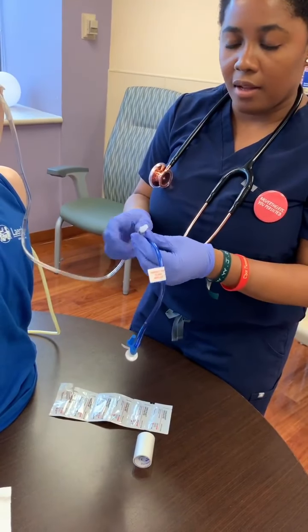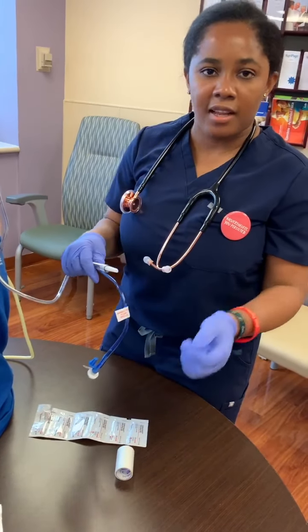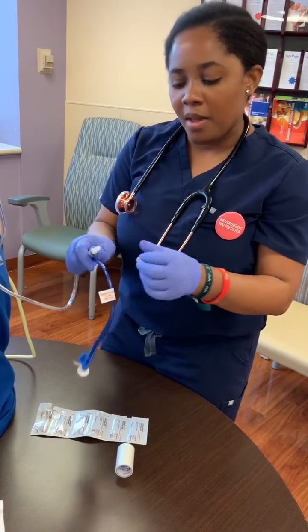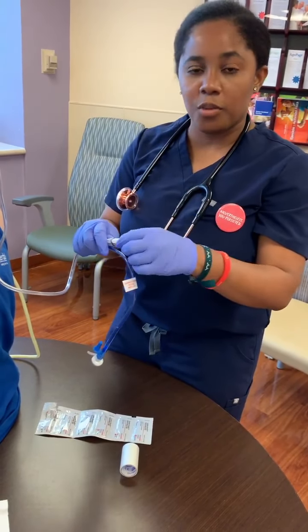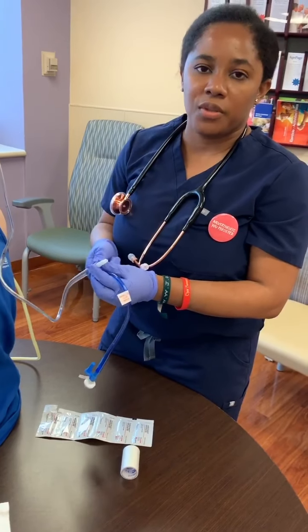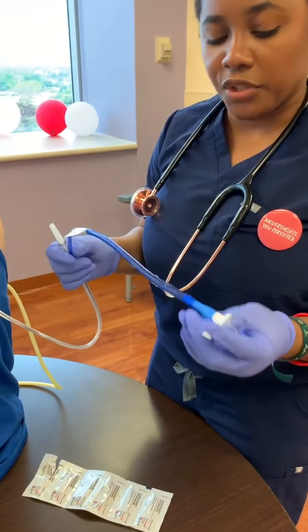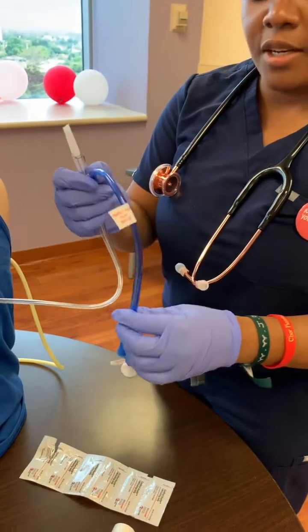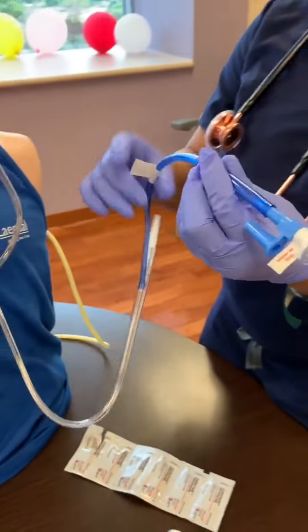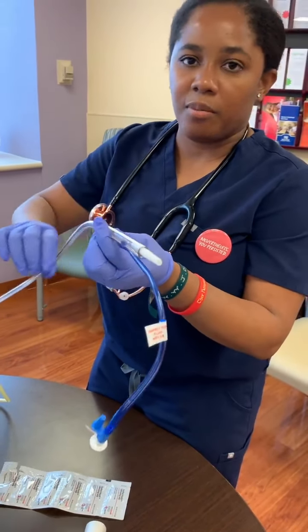I do not have this Lopez valve with me, but it's not uncommon in your facility to have a Lopez valve, especially if the patient is connected to feeding. It's like a three-way stopcock that's going to be attached to the actual tube where you're able to insert the tubing to the feeding. You also have an extra port where you're able to flush and insert medications if needed. Another really important part: the actual sump area — the blue portion — is where you're not inserting any fluids. It even says 'infused air only.' So only air goes in through the blue area, and fluids, medication, and feeding go through the actual tubing, which is the clear portion.